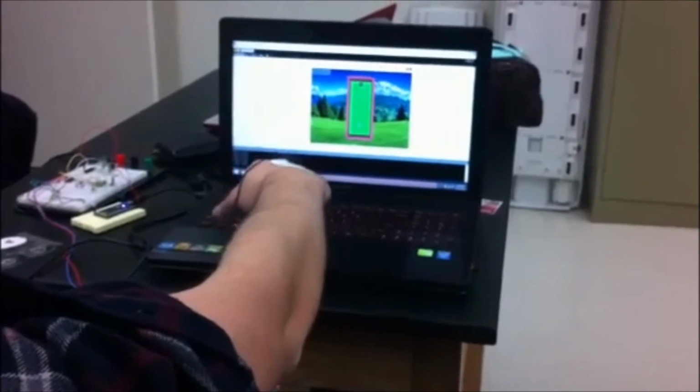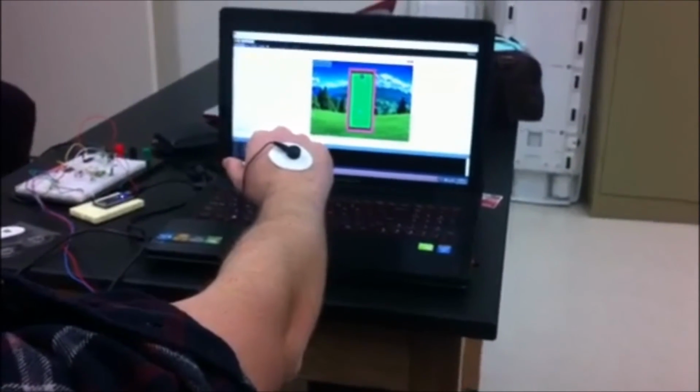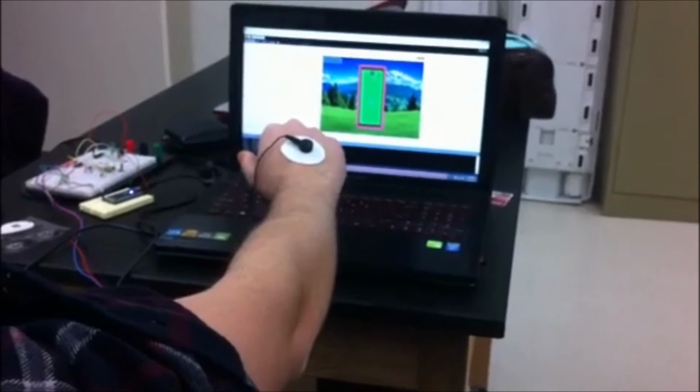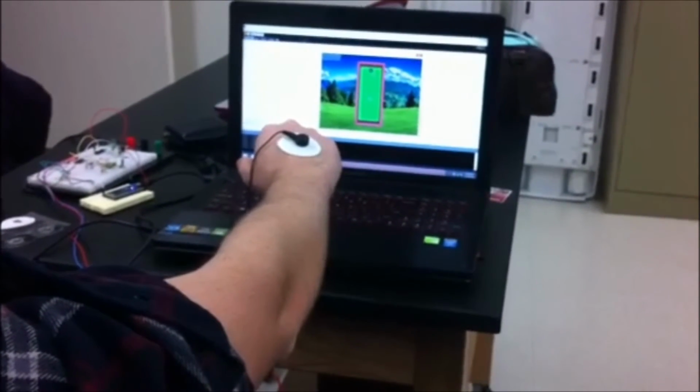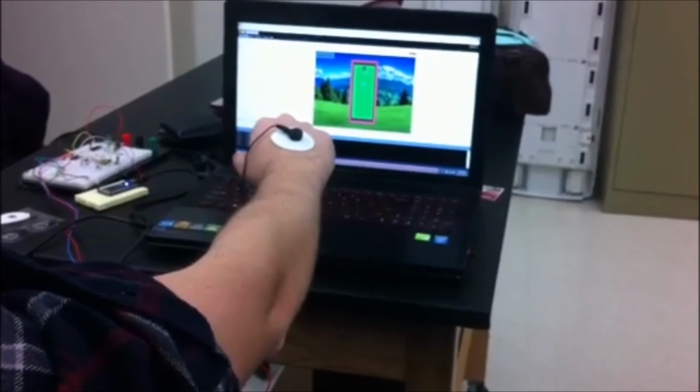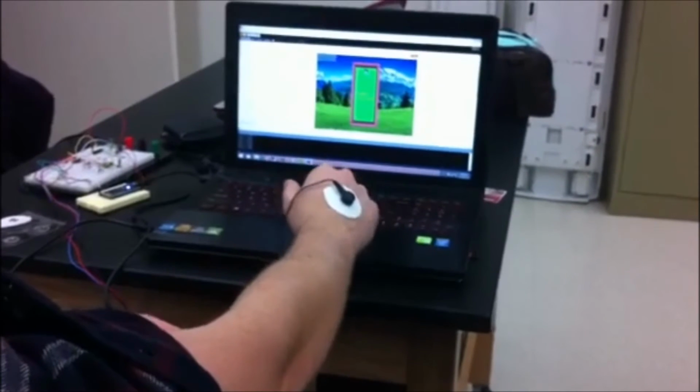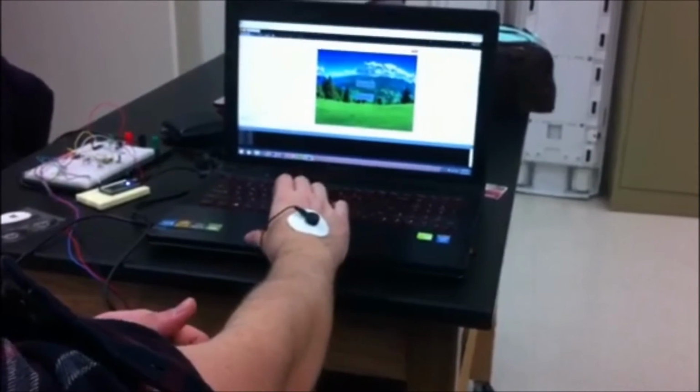So if I only flex a little bit, or for a really short amount of time, the ball doesn't move very much. But if I flex for a little bit longer, that one was a little tough. Now the ball will go all the way down to the end. So this is how you could use this as a training tool.